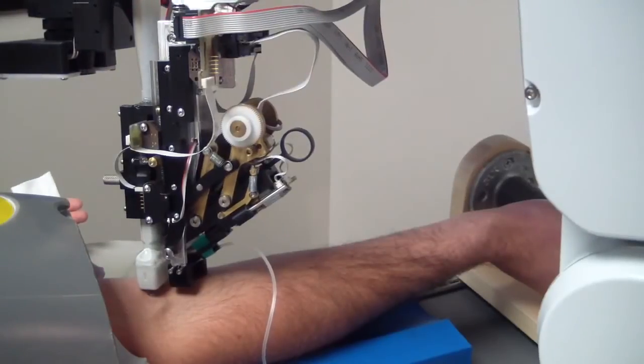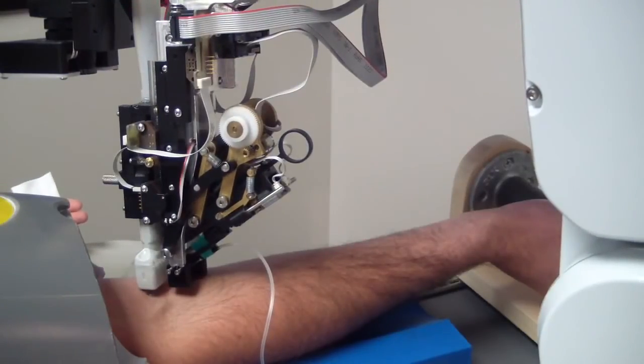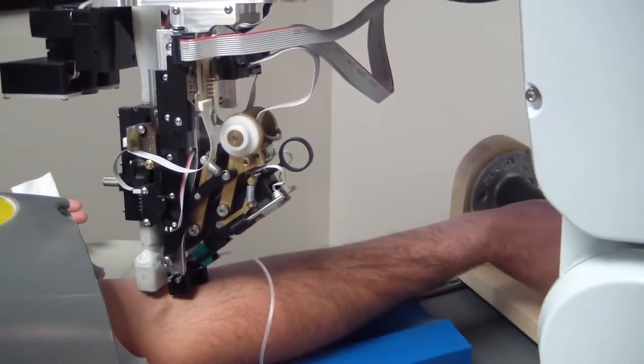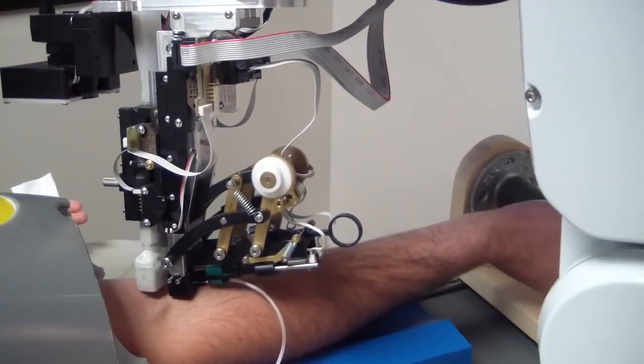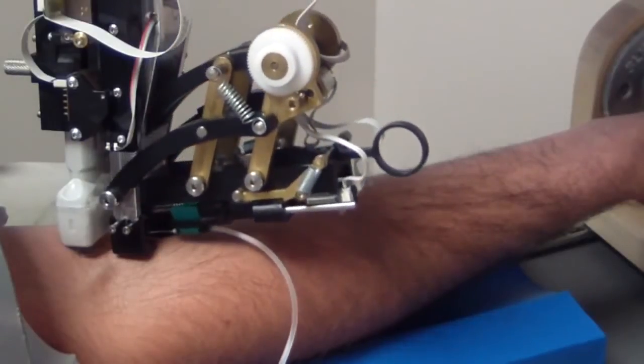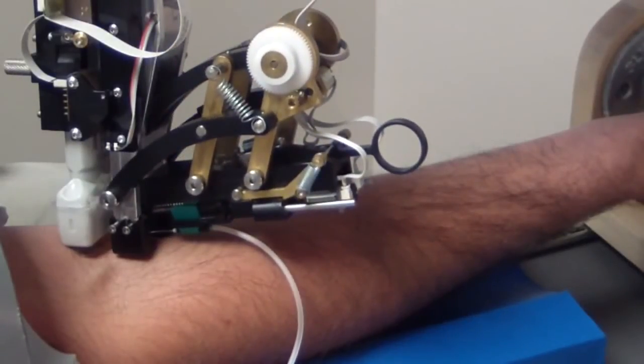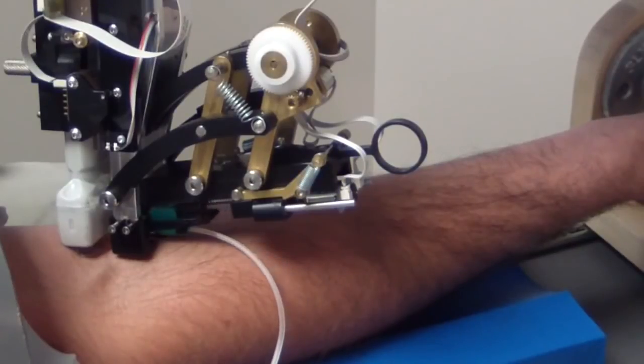Currently, V-Bot's machine can correctly identify the best vein to target about 83% of the time. That's about as good as an experienced technician. Company founder Stuart Harris plans to work the accuracy up to about 90% before starting clinical trials later this year.